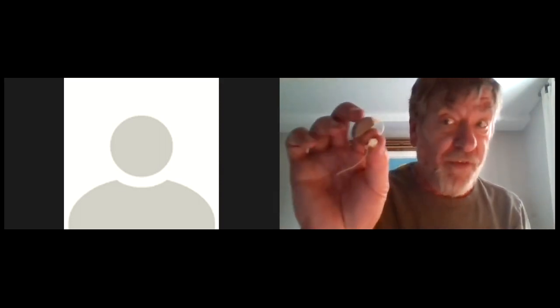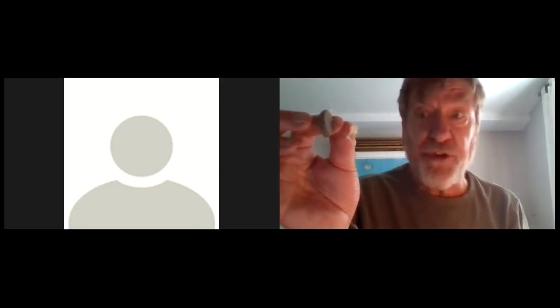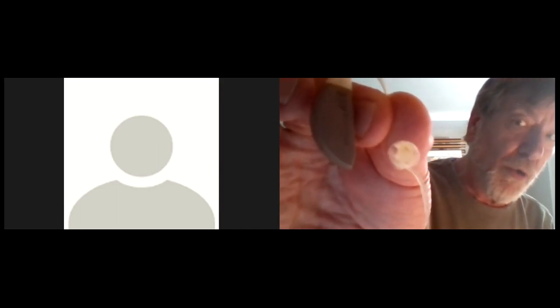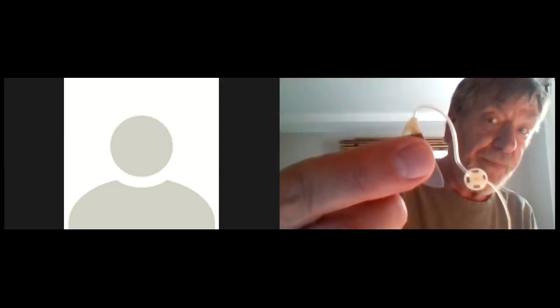So thin tube BTEs had to overcome that and have their amplifiers really pump out the highs to compensate for the loss that you're getting through that little thin tube. So there's two things to note with the tiny little BTEs like this. If it's a thin tube, you often have an open vent, and you can choose a dome with fewer holes in it. It doesn't have to be the great big honker holes. You can choose tulip vents and whatever the kind that have smaller holes in them. But the point is the thin tube itself can really knock out the highs.